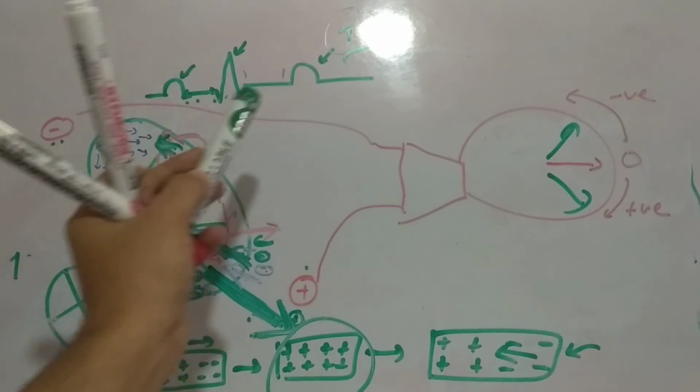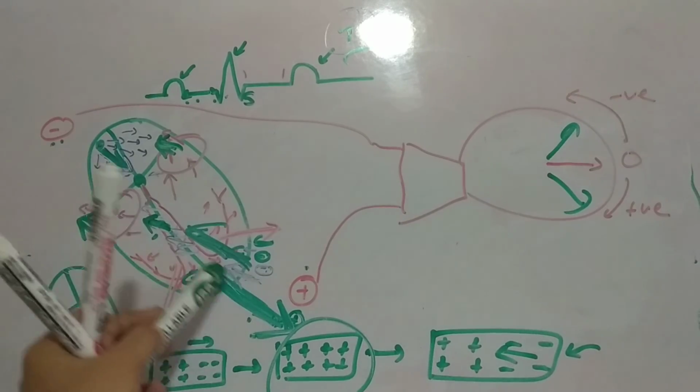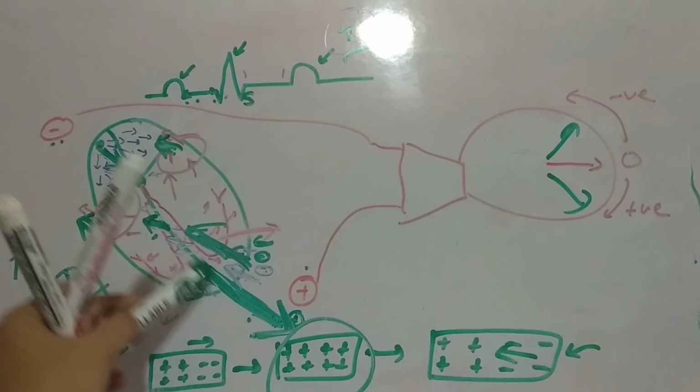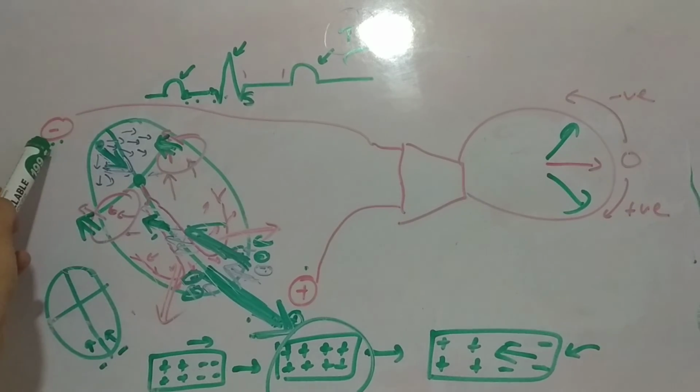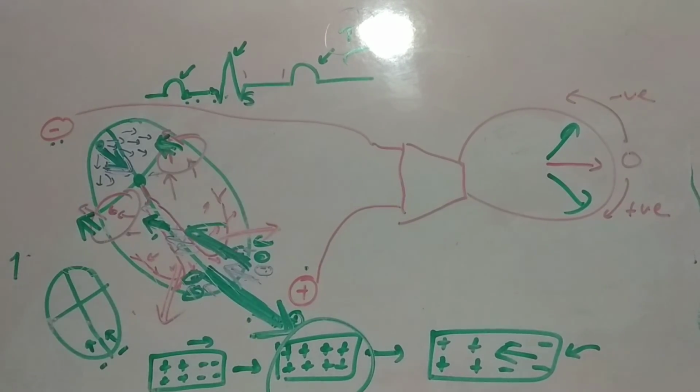And the T wave is the ventricular repolarization phase. Repolarization takes place from the apical portion of the heart, so the negative vector is moving towards the negative electrode. Negative going towards the negative will be a positive deflection. So this is the basic funda.